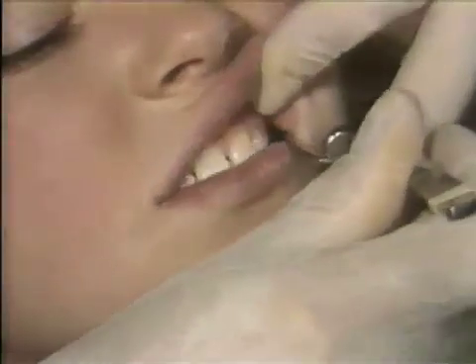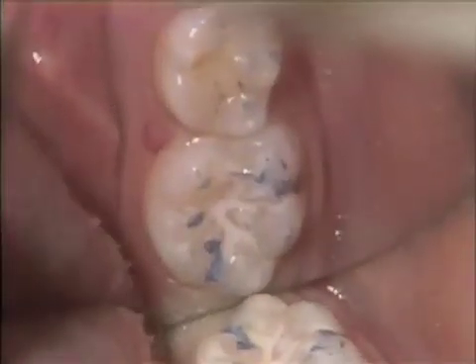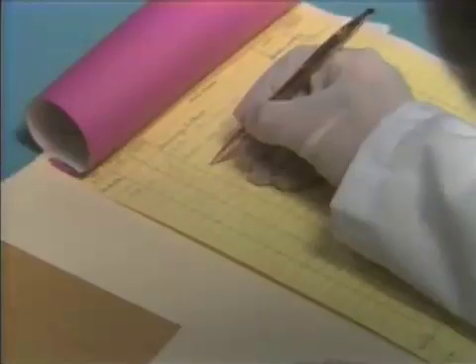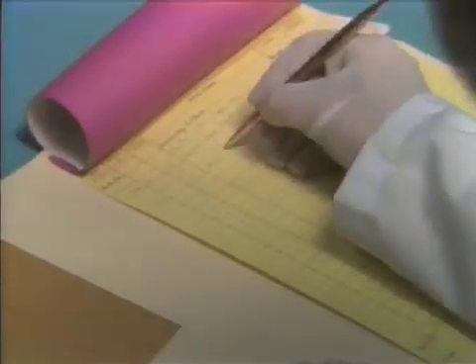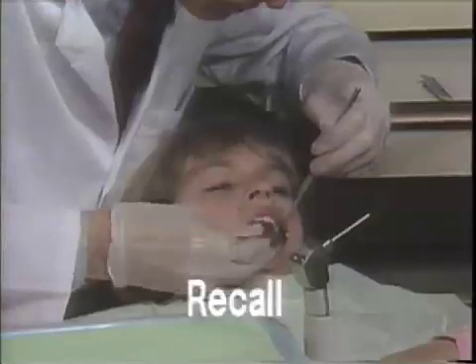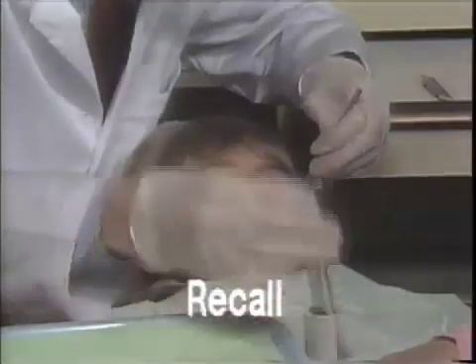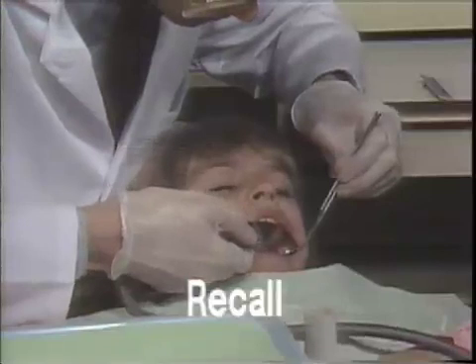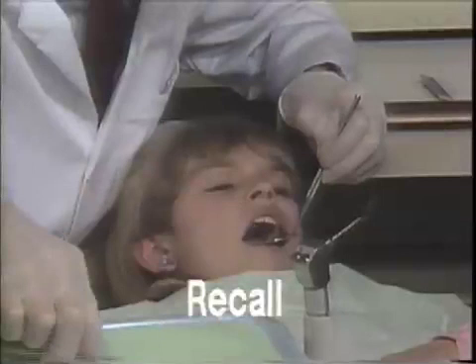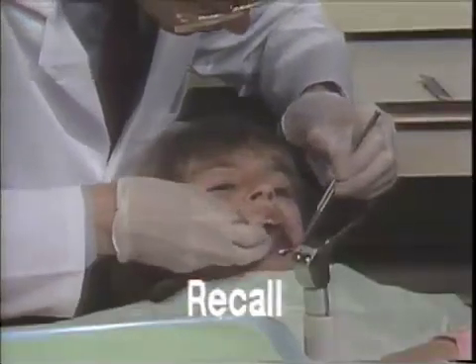The occlusion is then evaluated using articulating paper. A small, round carbide burr can be used to remove excess sealant. The specific teeth that were sealed and the color of the sealant should be recorded in the patient's chart. Since sealant loss is most likely to occur within the first 12 months of application, evaluation should occur within a year of treatment. Teeth should be dried and then examined using a mirror and explorer, and all pits and fissures should be covered with sealant.